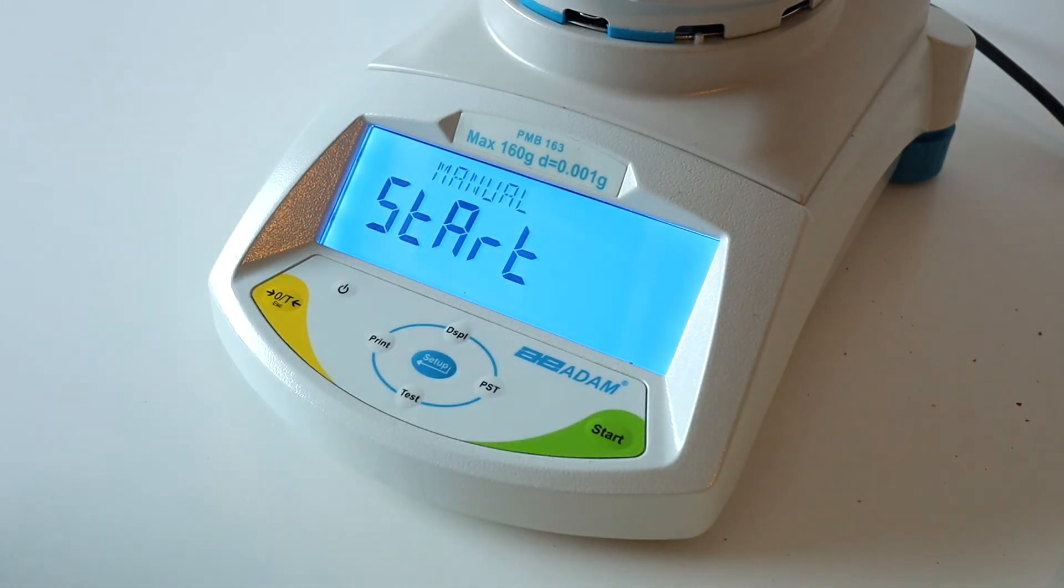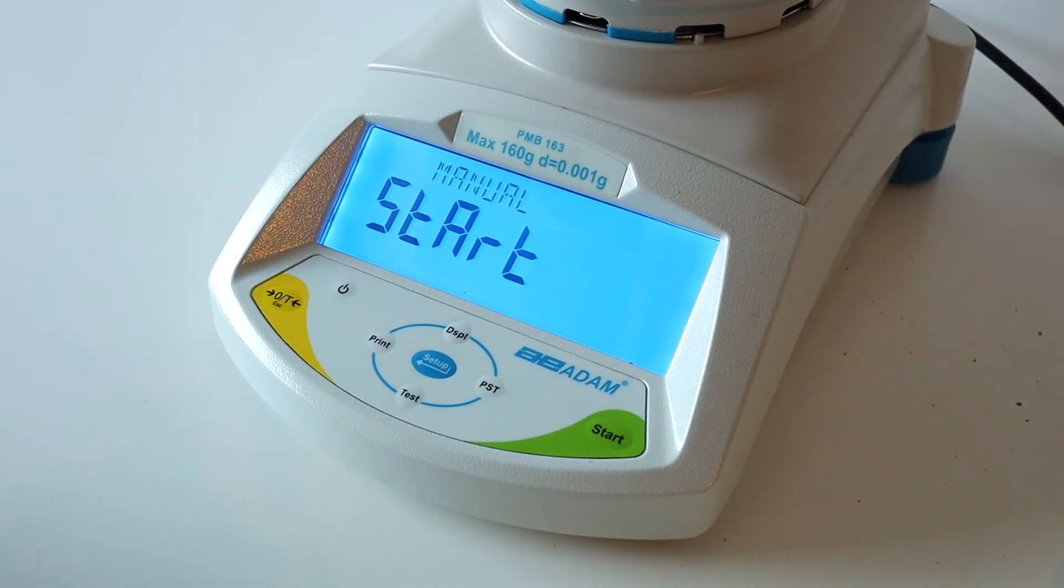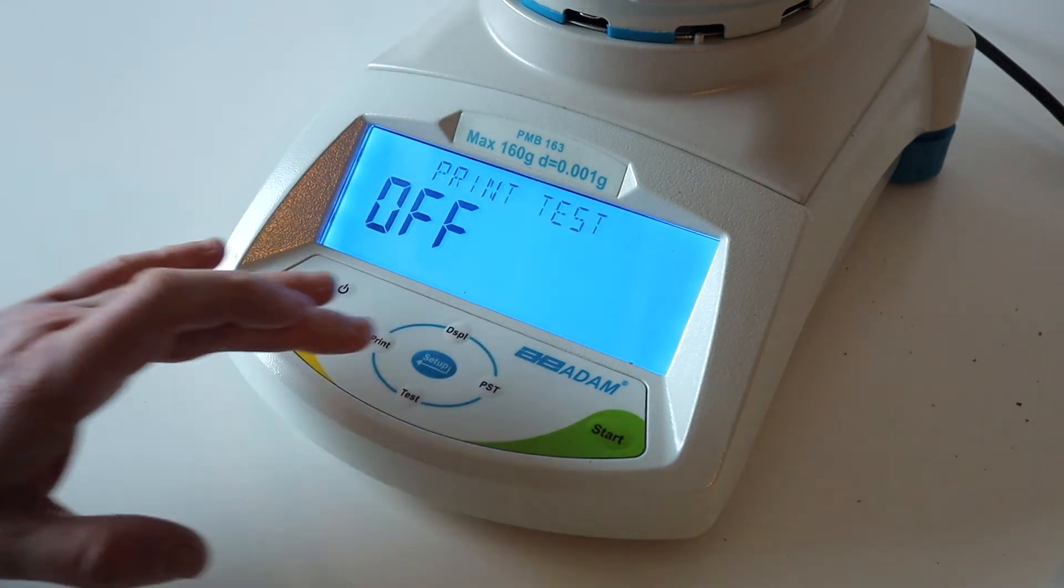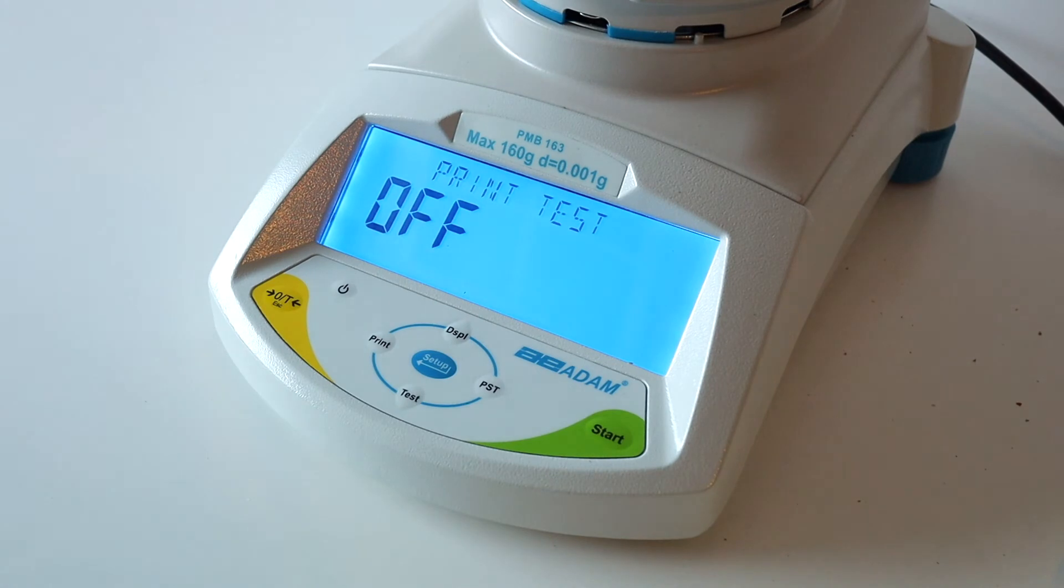With Manual Start, the process will begin when you press the Start key. With Auto Start, the process will begin once the lid is closed. Press Setup.